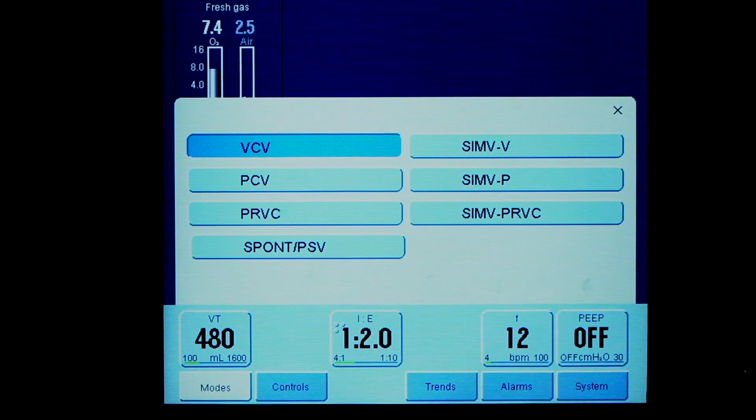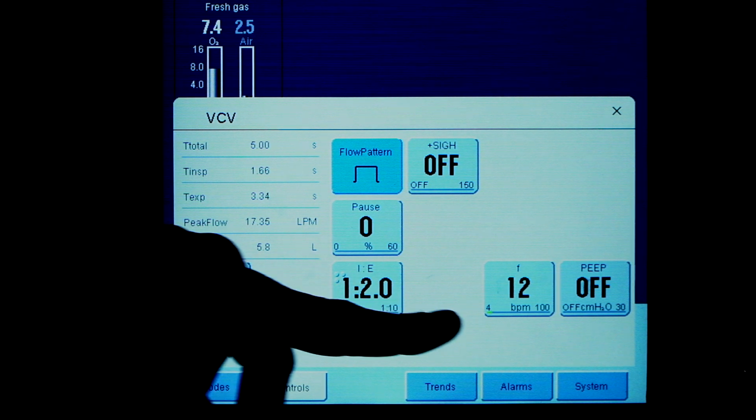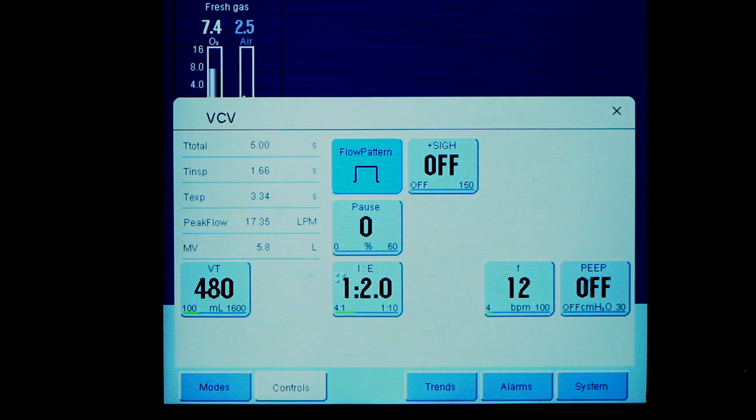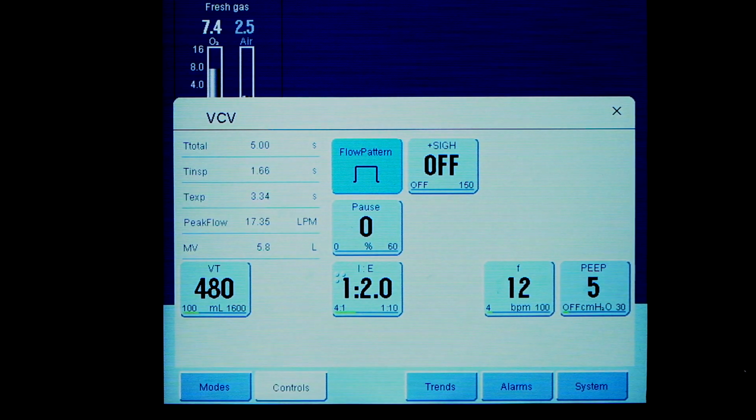So we've picked volume controlled, which is what the machine defaults to. If you press controls, you'll see what your options are to set on this mode, and I'm going to presume a degree of familiarity with this and say that actually you can set tidal volume, or I to E ratio, frequency or respiratory rate, and then PEEP. It defaults to a PEEP of off, which again you can adjust depending upon what you want. There are a number of other options that we're going to leave as standard, but essentially they don't really help us within intensive care, so we don't recommend that those are changed.